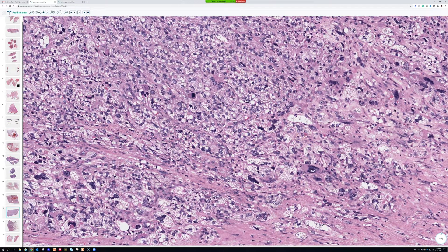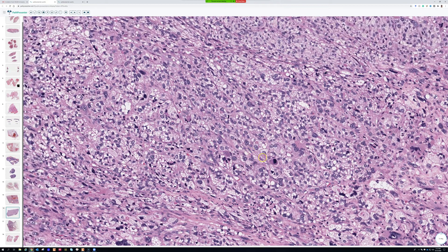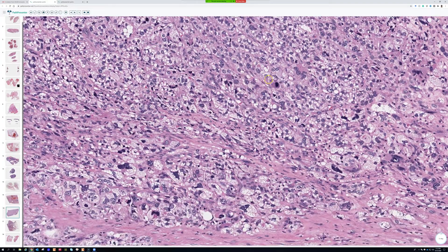There are two main patterns, and there's a lot of variability in pleomorphic liposarcoma. The two main groups — purely morphologic, with no clear behavioral difference discovered — are: they either look like cellular spindle cell pleomorphic neoplasms, or they can be sheets of epithelioid cells. A lot of people are more familiar with the pleomorphic spindle one that looks like undifferentiated pleomorphic sarcoma.